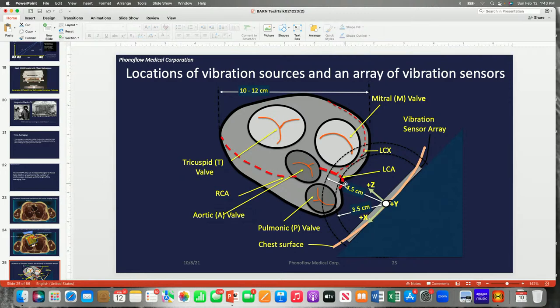Heart disease likes to go here first, it seems. You could find it on the posterior. Right now, we haven't placed this on anybody's back to try and hear in from the back on the posterior side. We're concentrating on the LAD.